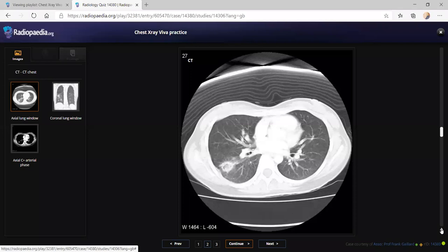However, the presence of the air crescent is likely due to the patient having started treatment. So probably part of the necrotic part of the lung is detaching from the necrotic process. I take that back. I think it is a good prognosis because this usually shows that the patient has started treatment. Yes.